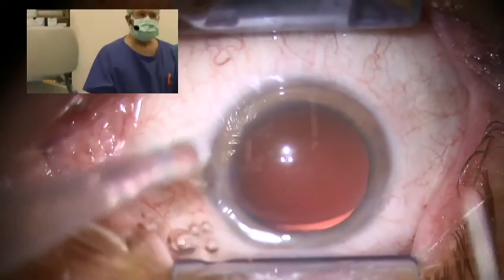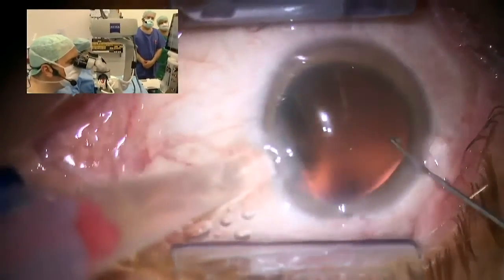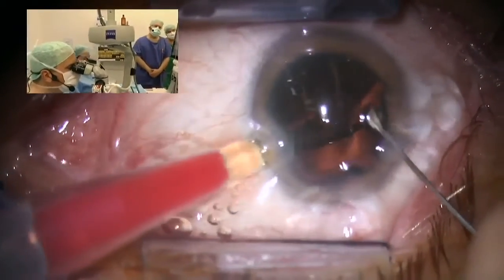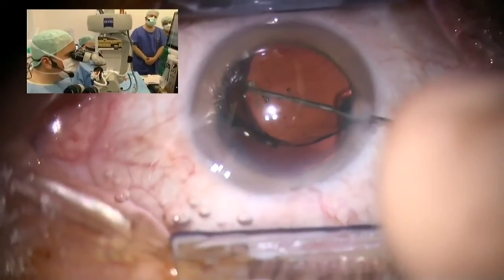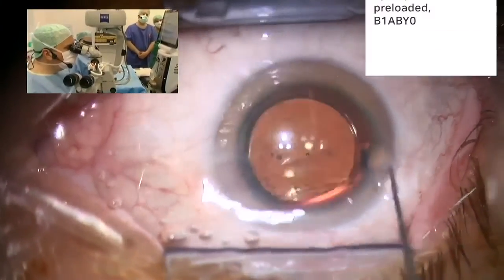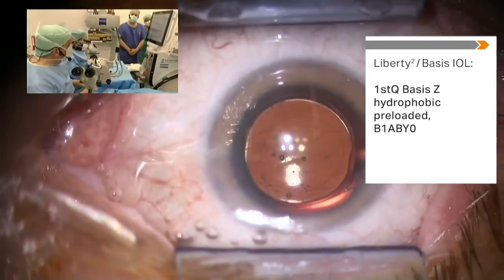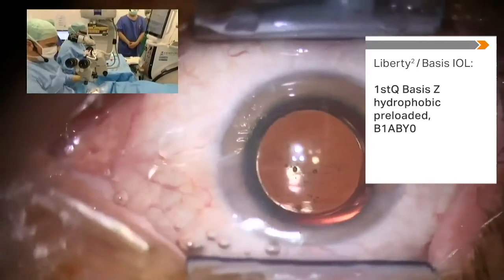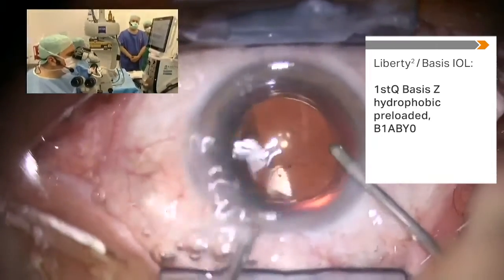Yeah, when colleagues are visiting us in the OR, I always tell them that my approach to the new technique is not to explain it as another kind of phaco. You have to listen to the interaction between the laser and the tissue. It is different. It's not another kind of phaco.